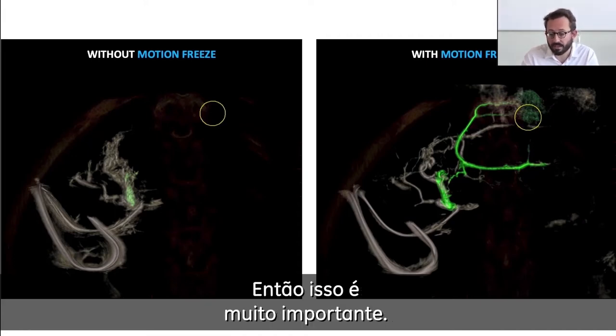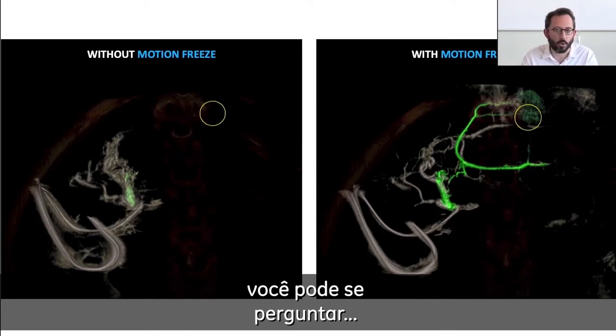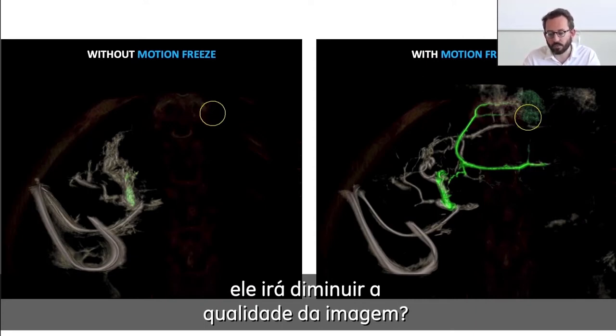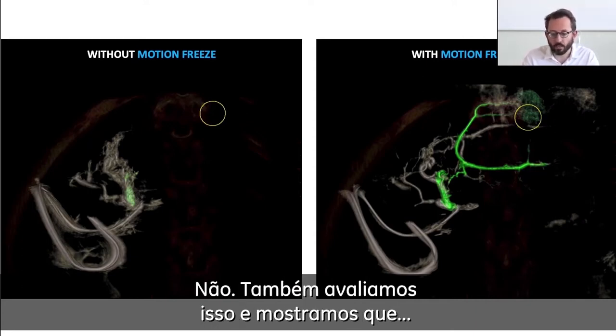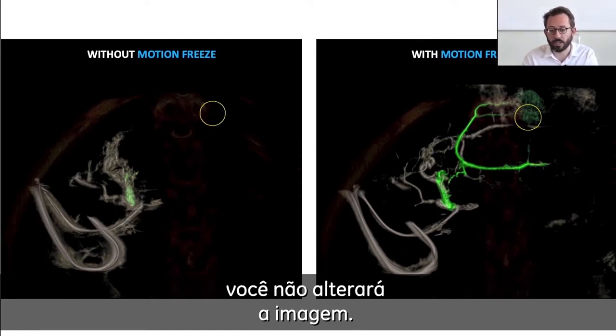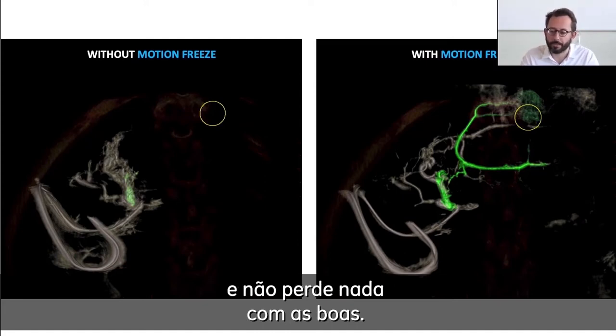So that's very important. And another thing that is important is that if you use that routinely, you may wonder, yes, but if I use that in a patient that was pretty still, is it going to, I don't know, decrease the image quality? Well, no, we also assessed that, and we showed that when you apply the Motion Freeze algorithm to a perfect CBCT, it will not change the images. So you only gain from the bad ones and you don't lose the good ones.